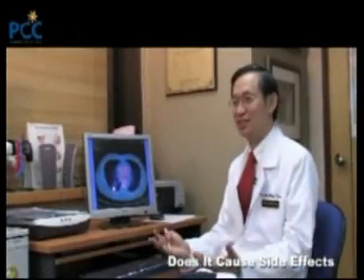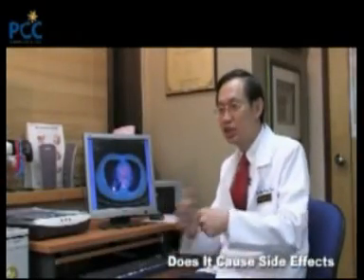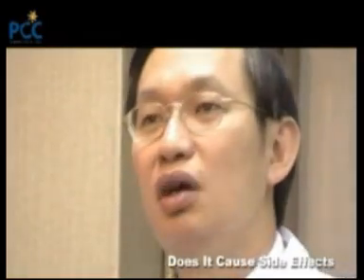No, it doesn't. I mean, basically you are injecting a tiny amount of FDG, which is a radioactive substance, but it is not harmful to the body. To me, the biggest side effect of a PET scan is really the cost involved. A PET scan in Singapore costs 3,200 Singapore dollars, and that's a big sum of money to pay, especially when you may need to repeat it again to establish whether the treatment is working or not working.